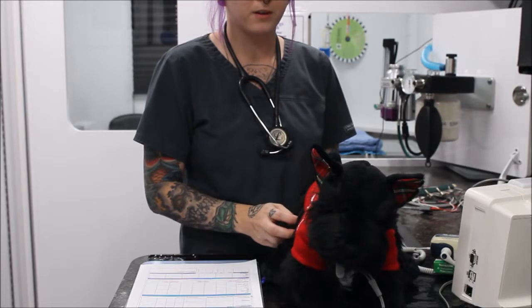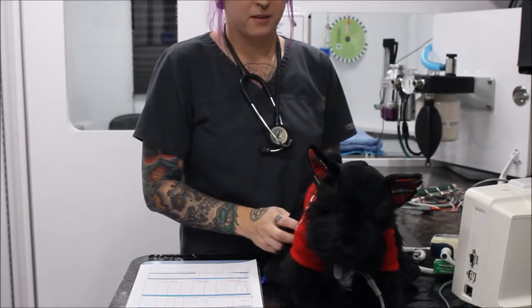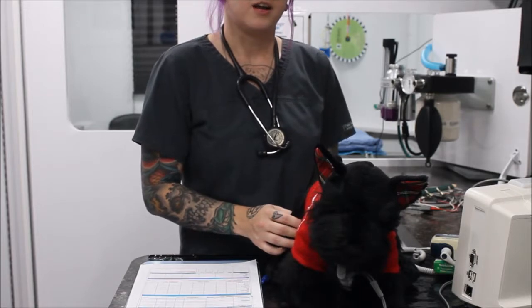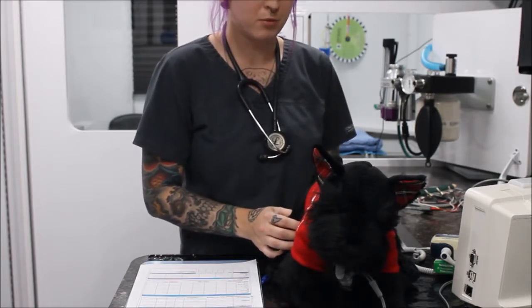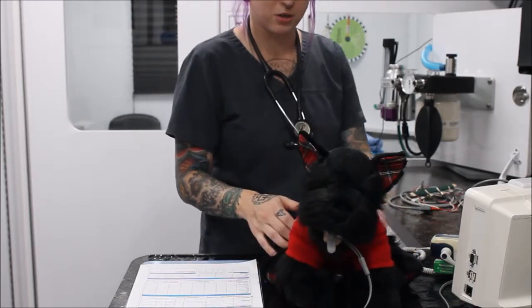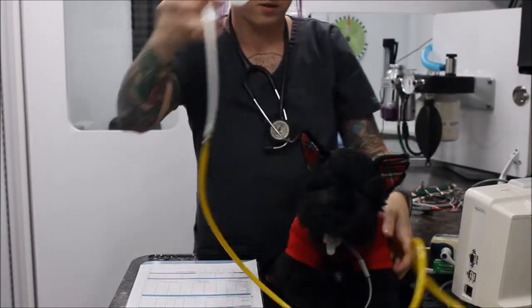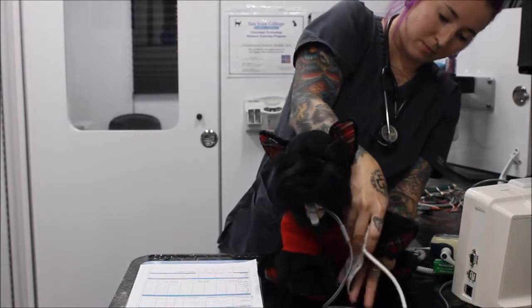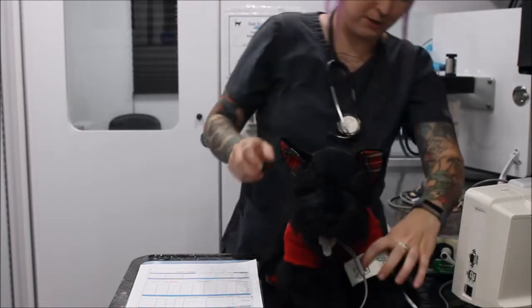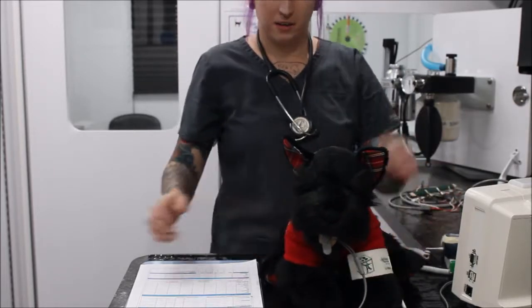If you feel a good strong pulse that's easy to palpate, that's what we're looking for. What we don't want is for it to be bounding excessively. That could indicate an increase in blood pressure, or if you're having difficulty palpating, that could indicate a decrease in blood pressure. We also monitor our blood pressure with our blood pressure cuff here. I think that cuff's a little small for your leg. That way during surgery we can keep an eye on the blood pressure.